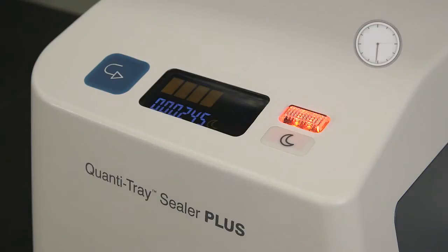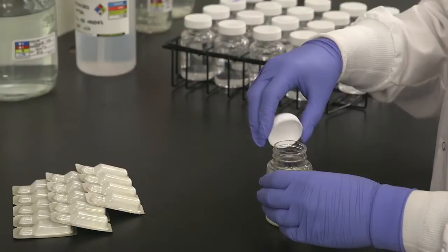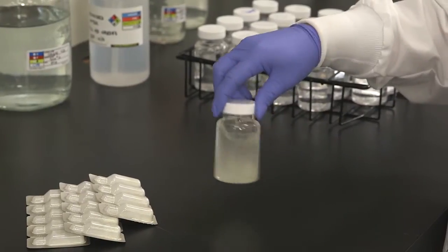Turn on the sealer and then wait until a green bar appears on the display — the sealer has now reached operating temperature. Add the ColAlert 18 powder to a 100 ml sample and cap the vessel. Shake until the reagent dissolves.